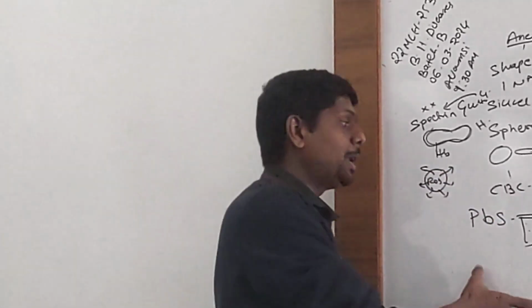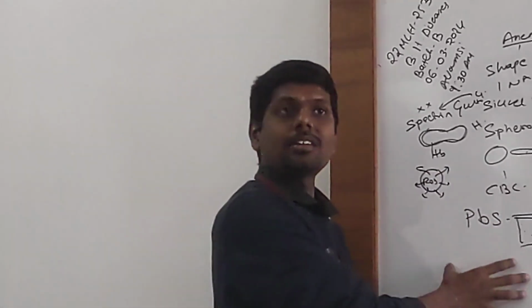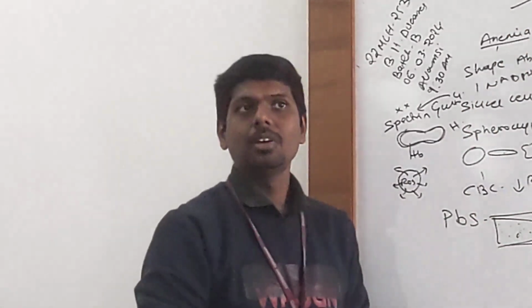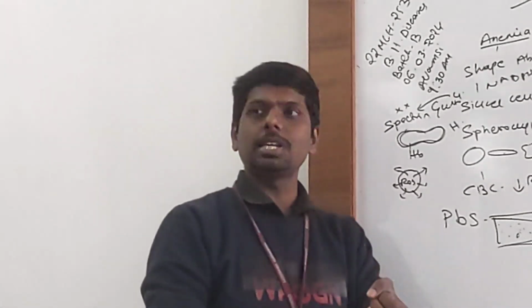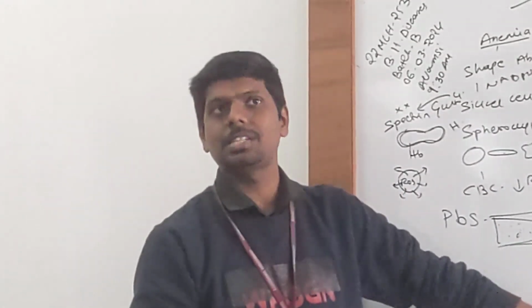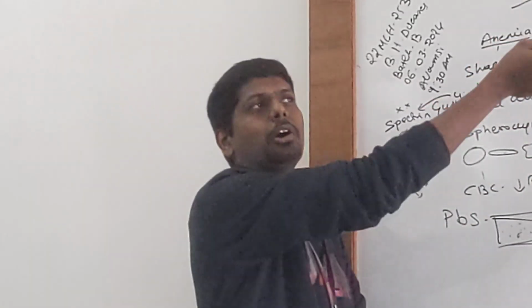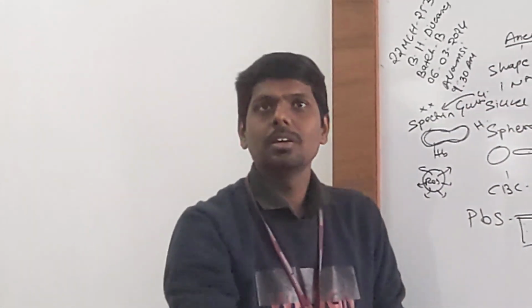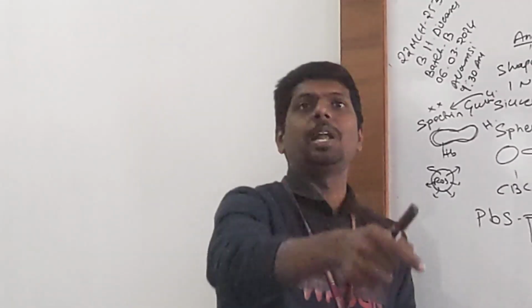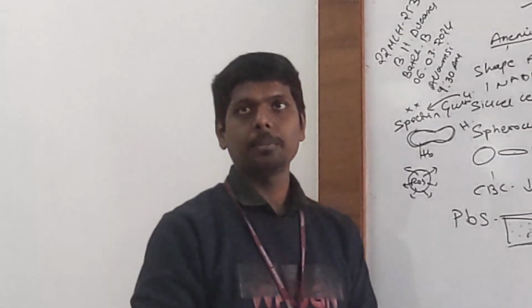Keep in mind, some of these blood disorders are very dangerous. They are there from genetics, but with this simple test, we can detect them. PCR, polymerase chain reaction, and electrophoresis are all 2,000 to 3,000 rupee tests. But the osmotic fragility test is around 50 to 70 rupees. You need a salt solution, that's it. Take a salt solution, keep a drop of blood, and you will get the results.